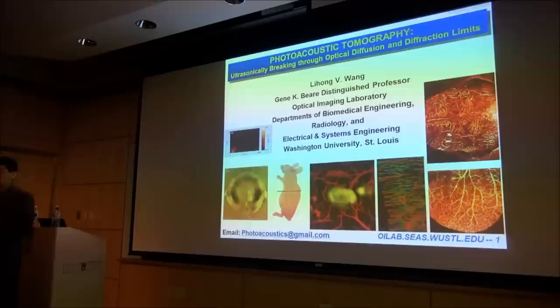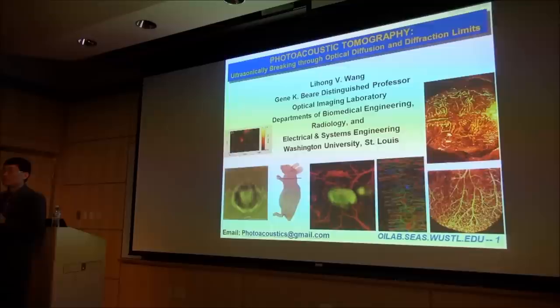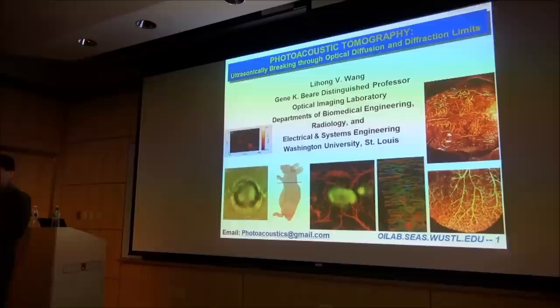Right. You know, obviously, that's a very generic problem in a lot of imaging modalities. For example, in pulse echo ultrasound, your ultrasonic energy is going to dissipate as it goes through. So one trick is to use time gain compensation, right? That was invented in the ultrasound imaging world. So for the deeper region, you multiply by a gain factor, which is basically the negative of the attenuation coefficient. That allows you to compensate, but it's somewhat empirical.